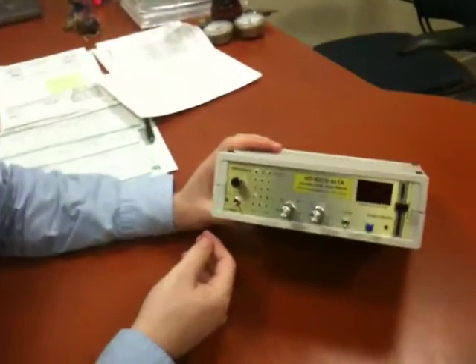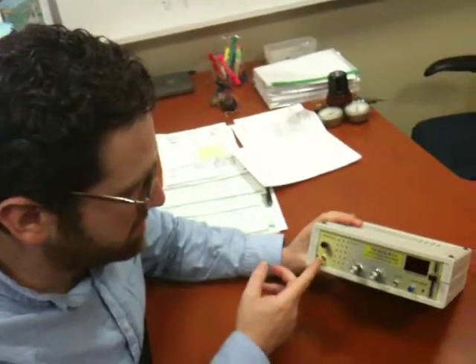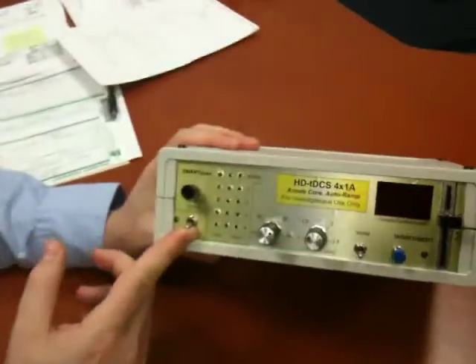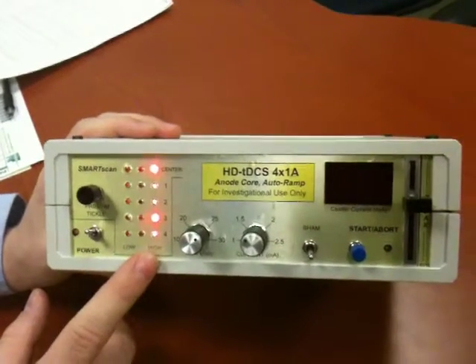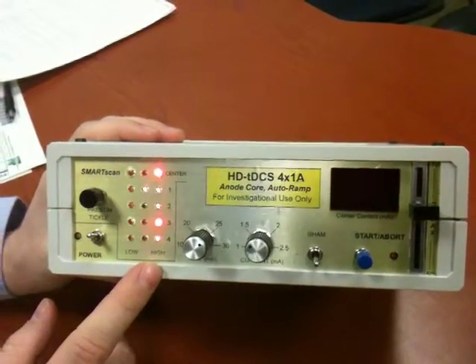So Eric and Andrew, this is the demo of the first generation active device. I'm going to turn it on now, and what you're seeing is the active scan — all channels are constantly being scanned for their integrity.